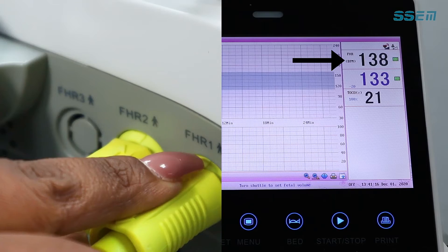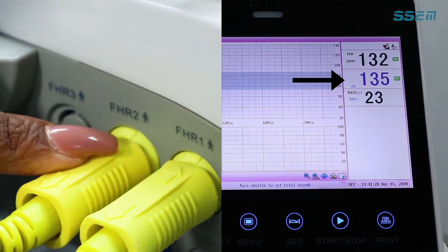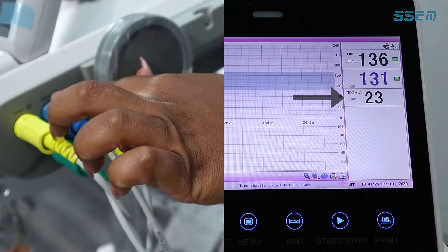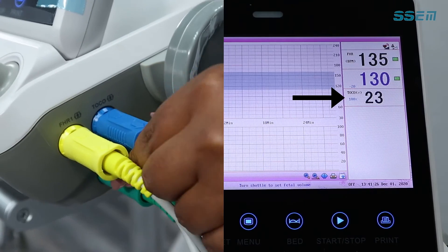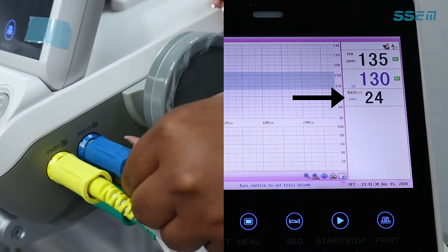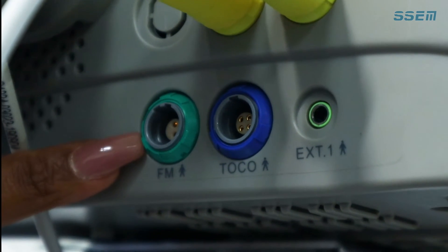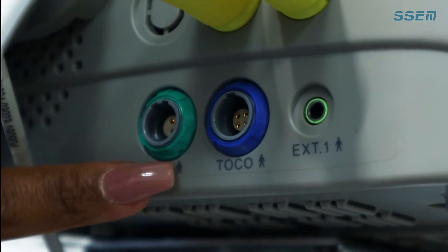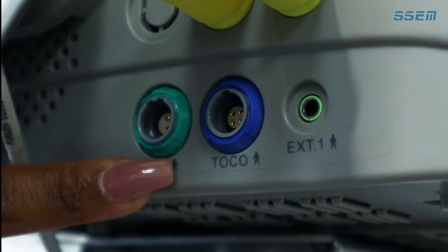This is FHR 1. This is the connection for FHR 2 on the device. This is the Toco connection on the device. It is also color coded and it's blue. And then your fetal movement marker is also color coded and this is where you would connect it.